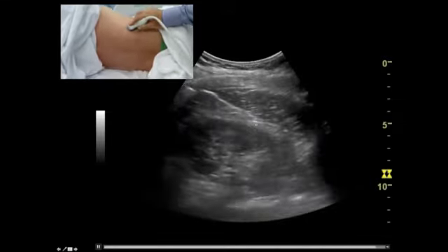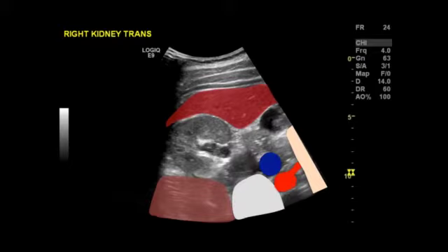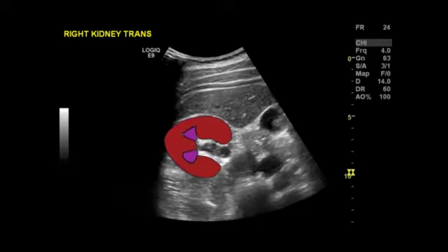And here it is in transverse, with the liver at the front. Here, some bowel with shadowing behind. Here, the psoas muscle. Here, the vertebral bodies with aorta and IVC. And then the kidney, gallbladder there. And kidney here, this rounded structure that you're seeing transversely now, like cutting a kidney bean in transverse or across its girth. And that with the relatively hypoechoic medullary pyramids, and then the surrounding cortex, and then in the middle, that echogenic renal sinus there, and in the middle of that, the hypoechoic collecting system.